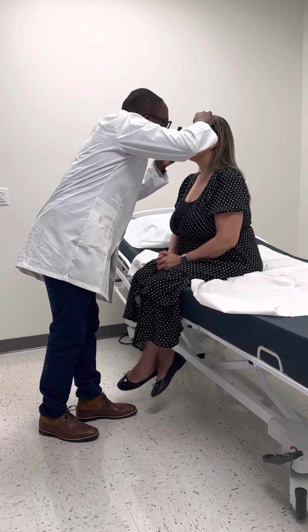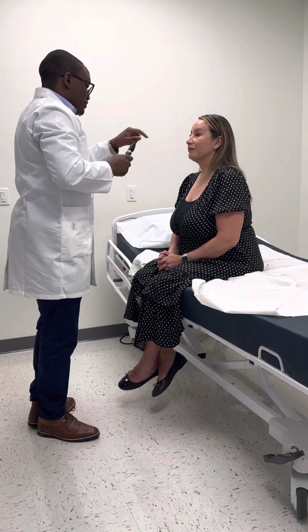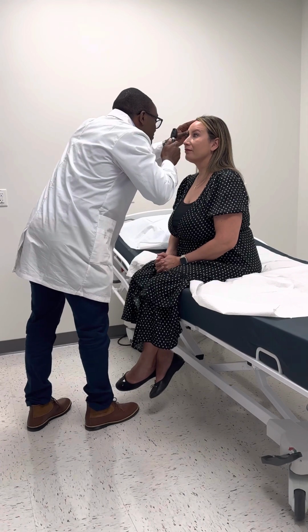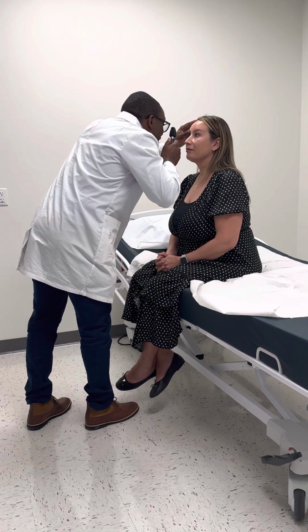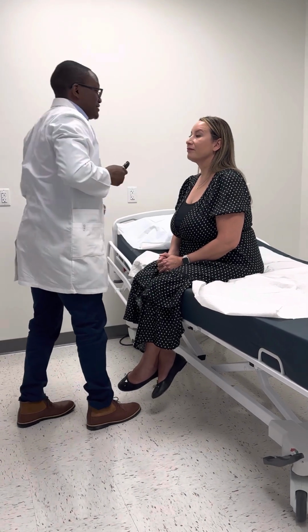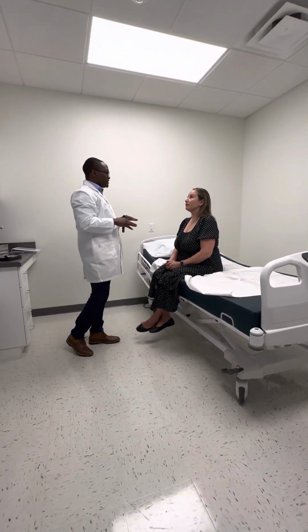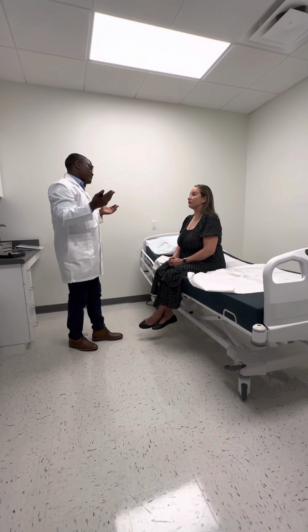I can see the red reflexes. I forgot to check the red reflex on this side, please. Yes, I can see my red reflexes. So we've been able to see the red reflexes in both eyes. In both eyes, I'm able to see the macula.